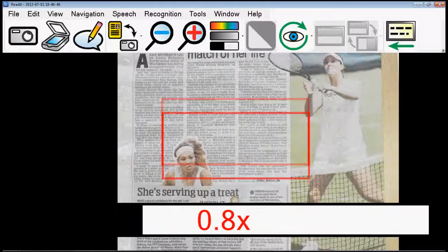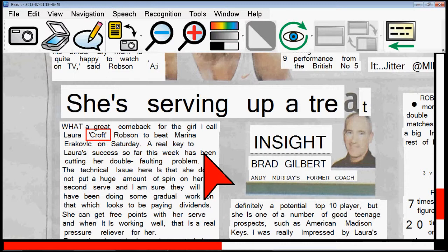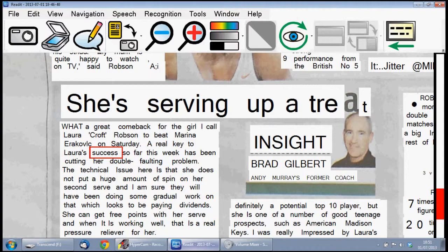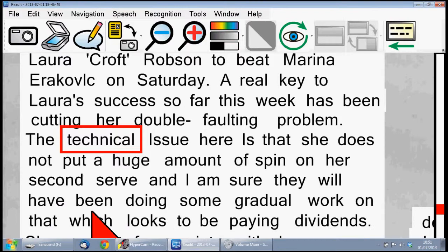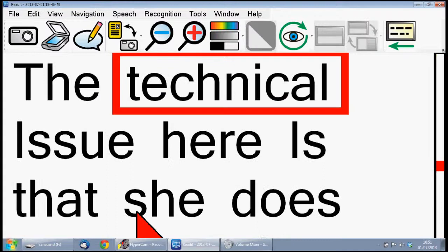Let's zoom out and go somewhere else. We've got an overview mode so we can look at something else. Click back on this bit, click on a word. She's serving up a check. What a great comeback for the girl — Laura Robson to beat Marie Marrero from Saturday. A real key to Laura's success so far this week has been fixing her double faulting problem. We've also got all the standard reformatted modes — column, horizontal, vertical view, and single word.